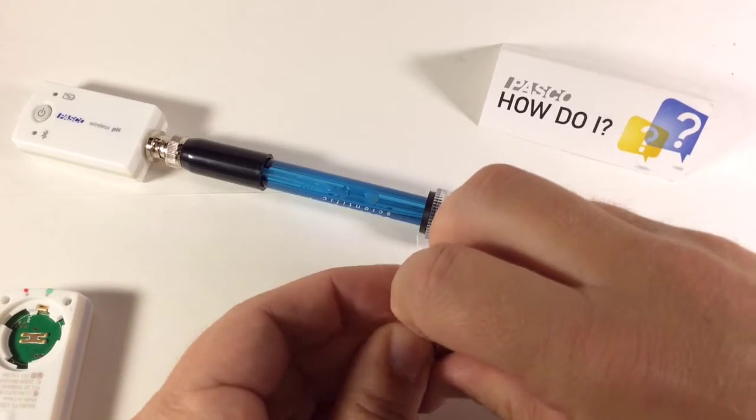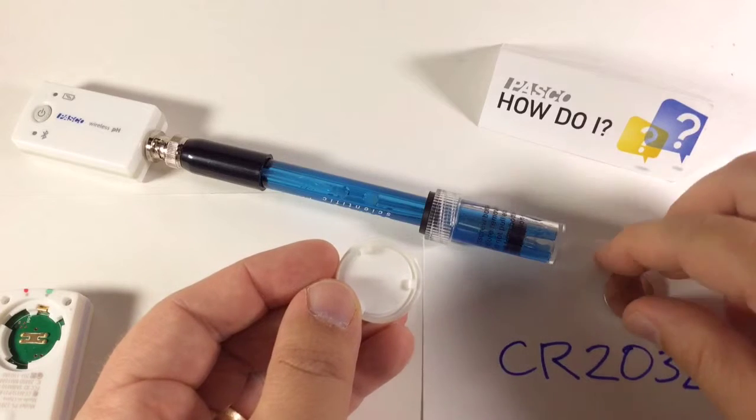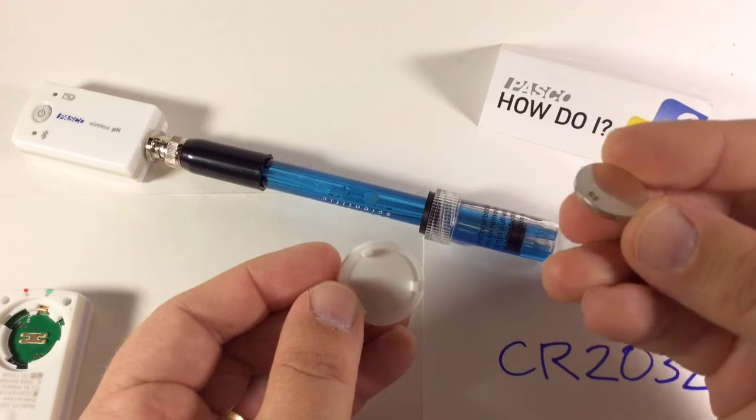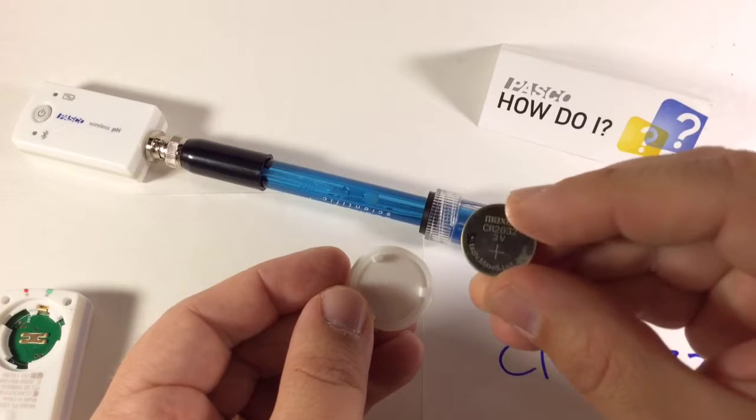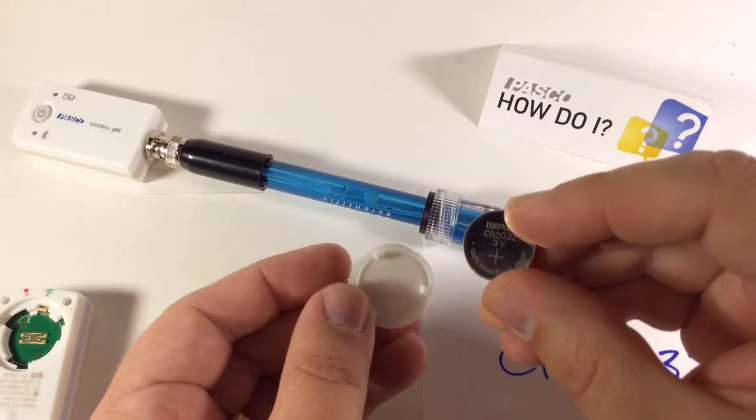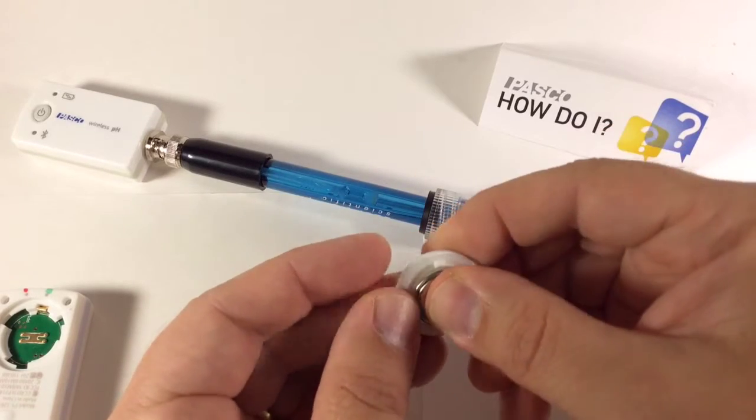So I'm going to remove the old battery and dispose of it properly. And I'll take my new battery, and I need to identify the positive side. The positive side is a little bit thicker, and you'll see a positive symbol plus sign on that.